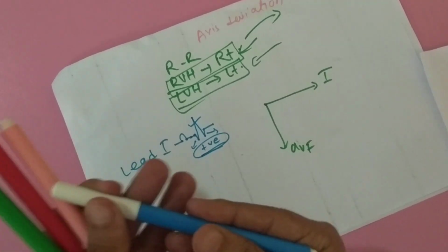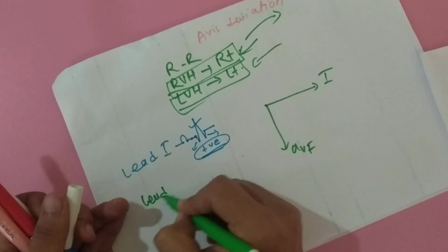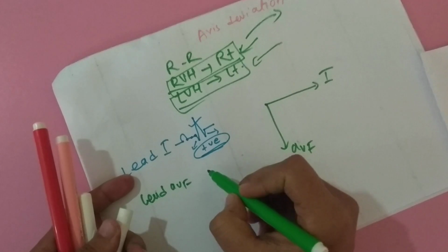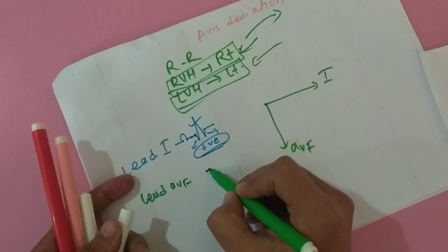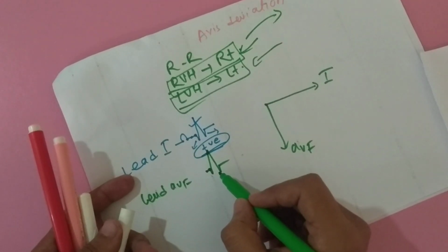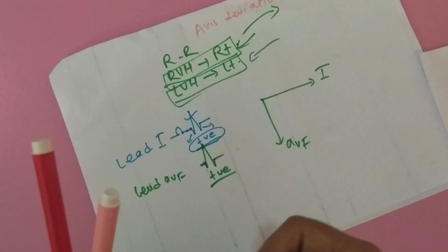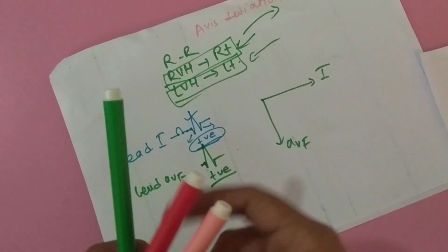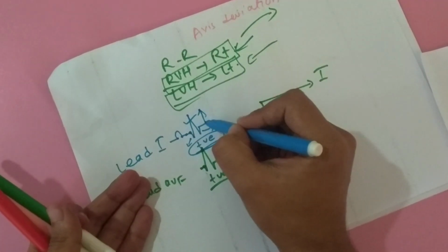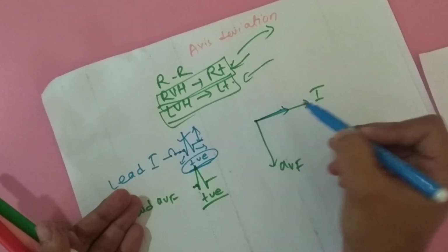And let's say another example, in case of lead AVF, suppose in lead AVF I find a QRS complex like this. Again in this case the QRS complex is a positive vector, so positive deflection is there. So when I plot them, in lead 1, suppose this is of magnitude 4 millivolt, suppose up to here it is 4.